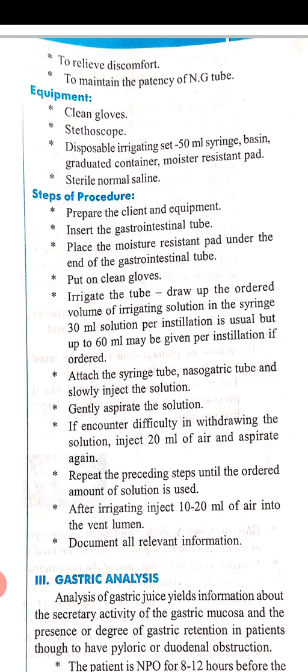Then attach the syringe to the nasogastric tube, slowly inject the solutions, then gently aspirate the solutions.